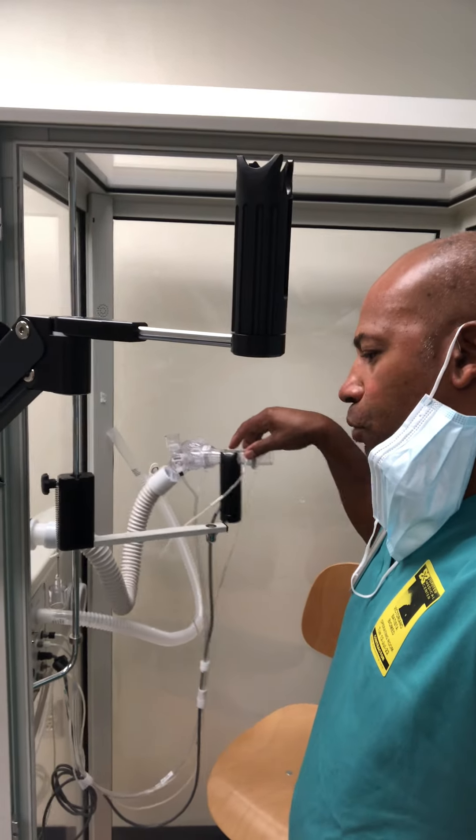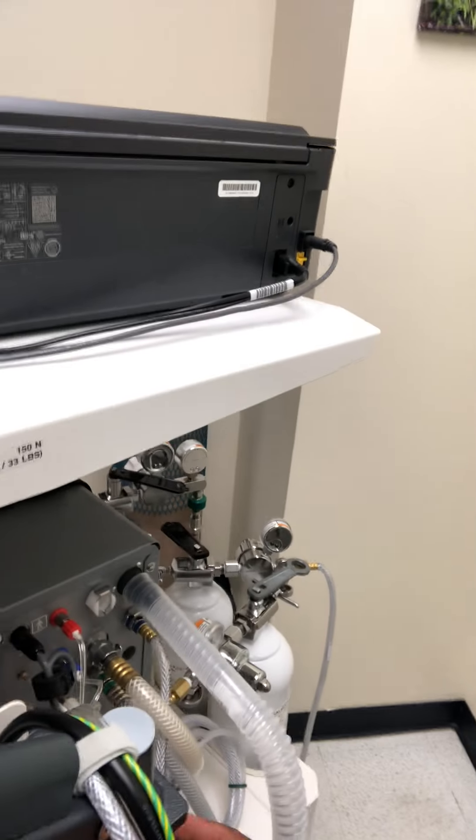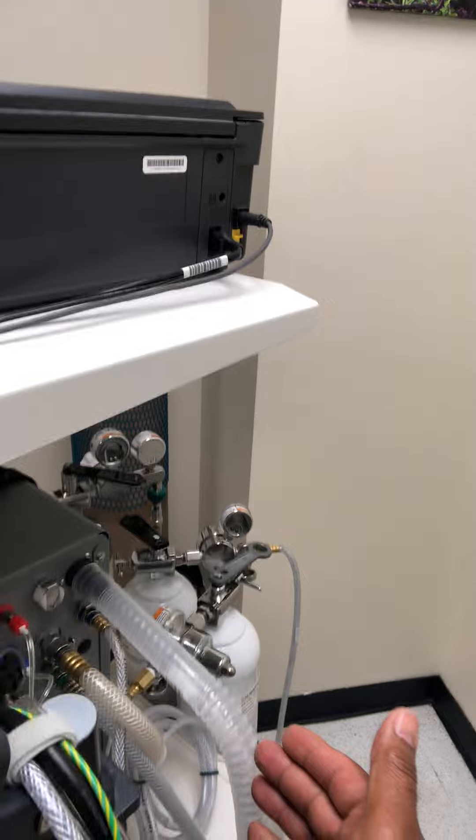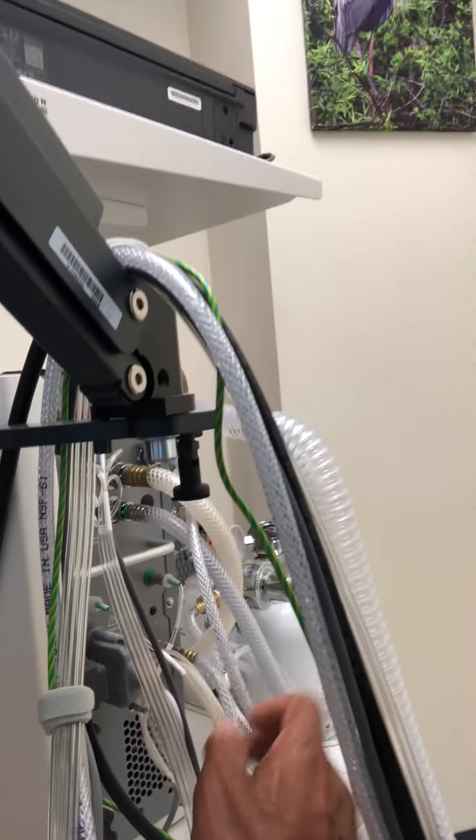These components should be replaced during regular maintenance. Some of the areas I should say — with the tubing back here — these are all part of the preventive maintenance, and we want to make sure that all these are properly connected afterwards and that there are no issues or leaks with the unit.